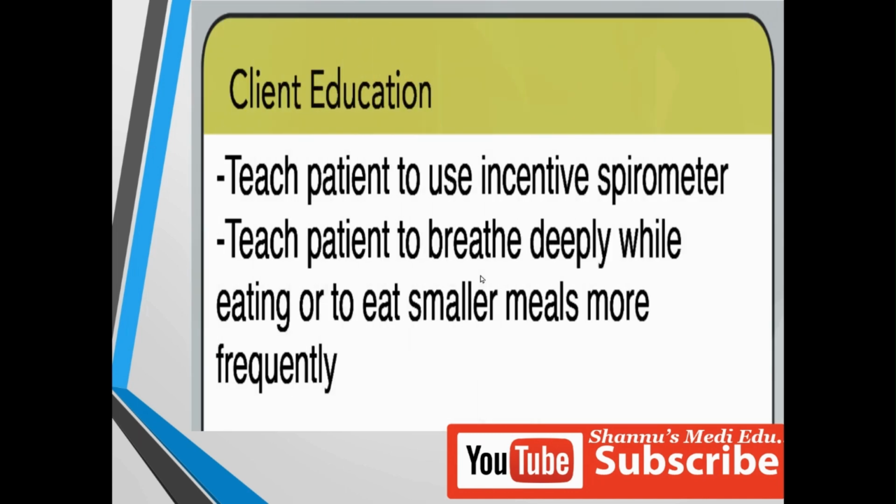Client education. Teach the patient to use the incentive spirometer. For a hypoxia patient, the lungs may be affected, so he will go into hypoxia. The spirometer will increase the patient's lung capacity and self-intake of oxygen, so it will be very useful.